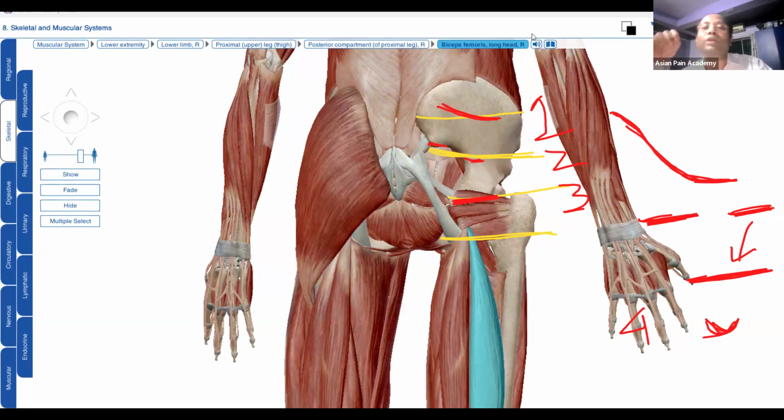This is the fourth. All this I am talking about is the bony surface architecture. From seeing the bone, we can understand the bony margins. By ultrasound, we will see the periosteal margin. By seeing the bony margin, we will understand where we are located at that point.